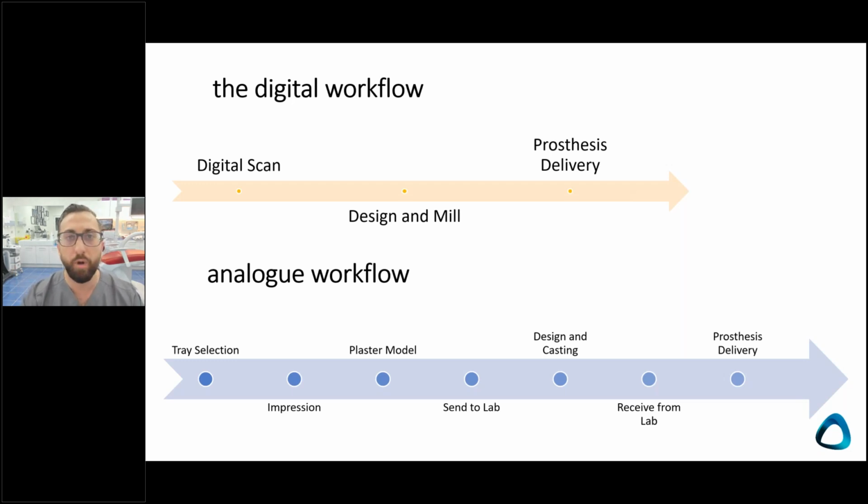Compare that to impression, pouring up the impression, disinfecting it, sending it to lab. And these days in a COVID era, or let's say post-pandemic era, I think cross-infection and disinfection is more important than ever before. And minimizing this handling of impression material, I think, is critical.